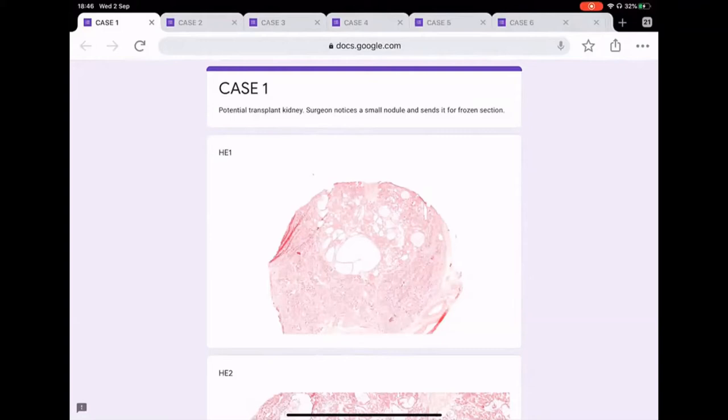Obviously, if you are able to say that this is malignant because you saw a lot of bizarre atypia and you saw a lot of abnormal mitotic activity within this spindle cell neoplasm, then there is nothing to stop you from calling it malignant spindle cell neoplasm, right? But again, that's as far as you will take it. And then you will say defer, right?